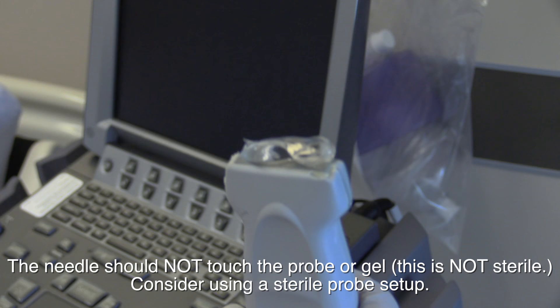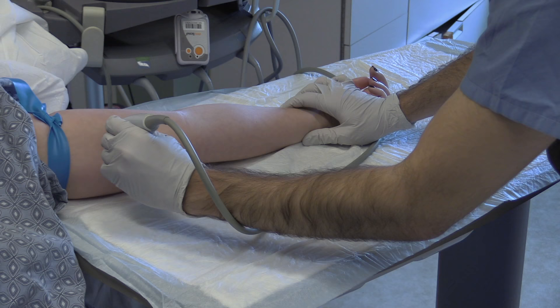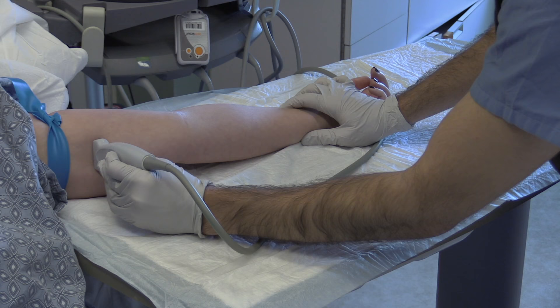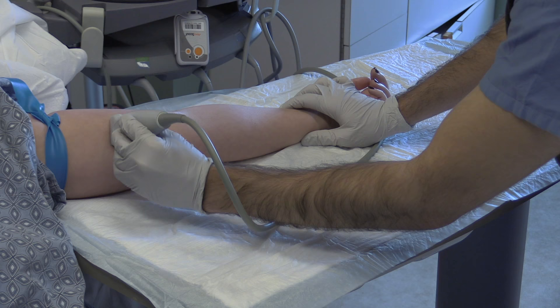Choose the vascular probe and apply gel. Search for a venous structure with an acceptable diameter and a relatively straight course. It's difficult to cannulate small or tortuous veins. If there are no suitable veins distally, the proximal veins are often acceptable. If necessary, examine both arms to find the best vessel — this will make the procedure smoother and reduce sticks for your patient.